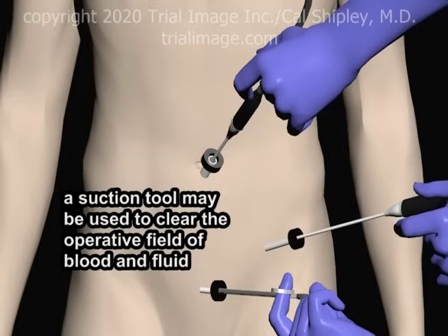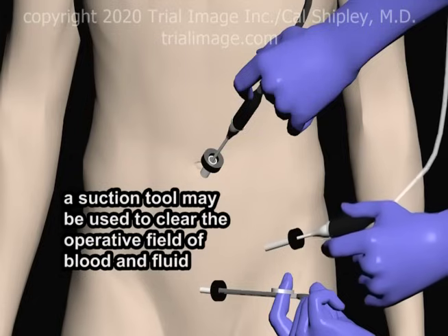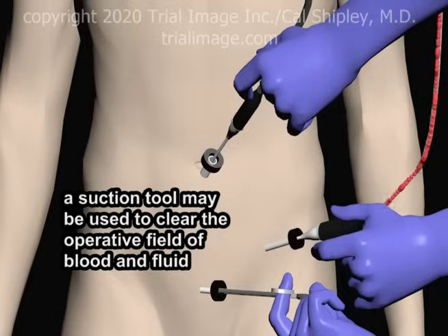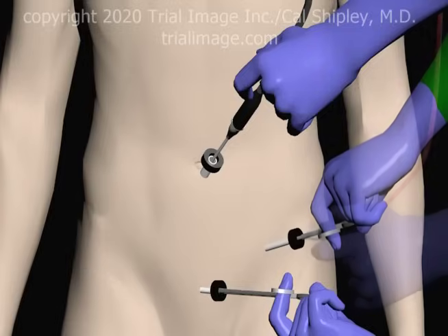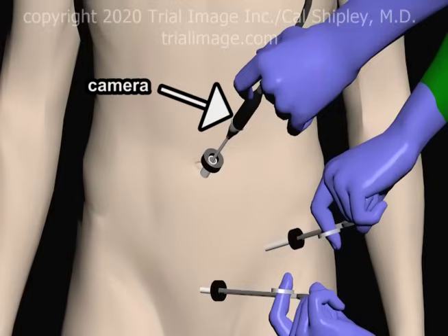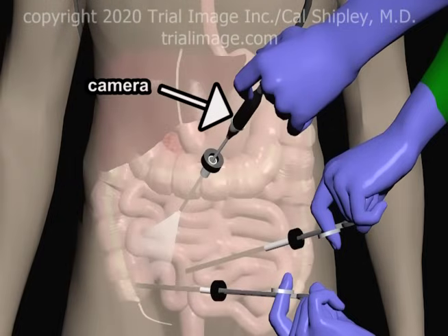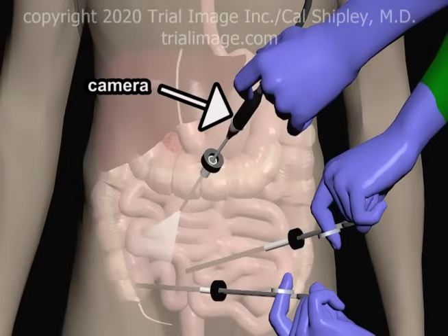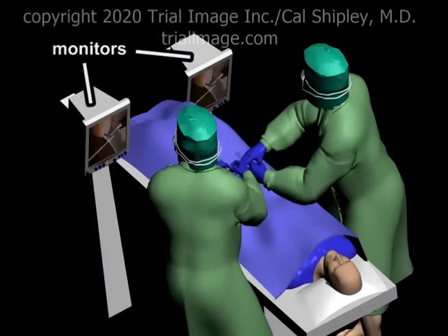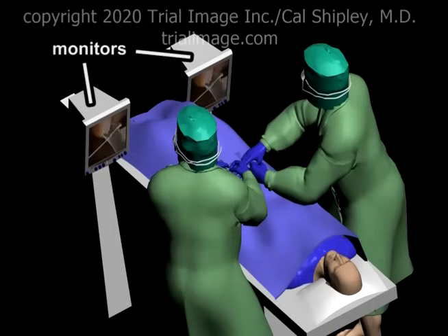One of the instrument ports may be used for a suction tool to remove blood and excess fluid from the operative field as needed. The peri-umbilical port holds the laparoscopic camera, which provides the surgeon and her assistants with a view of the operative field throughout the procedure. Operating room video monitors display the images generated by the laparoscopic camera.